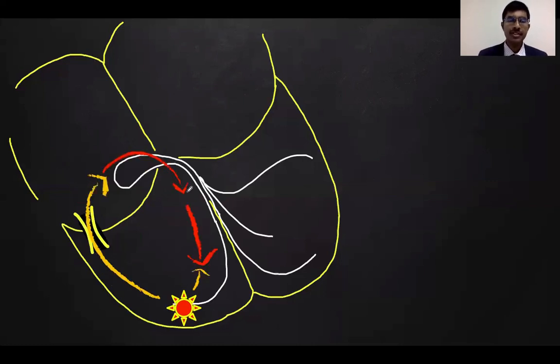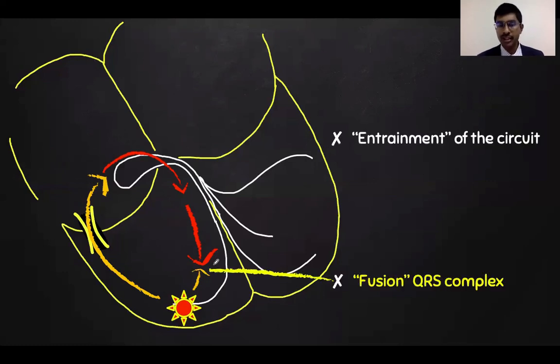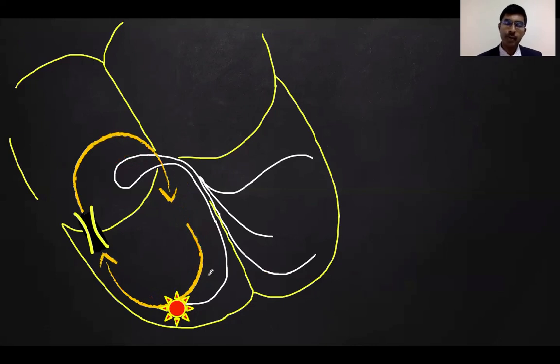If it gets past the accessory pathway into the atrium, then it would advance the atrium to its own cycle length. That might be evidence of fusion on the surface ECG. These fused QRS complexes are because of the collision of the wavefronts from the pace stimuli and that during the tachycardia. With continuation of ventricular pacing, the whole circuit is now reset to the paced cycle length.